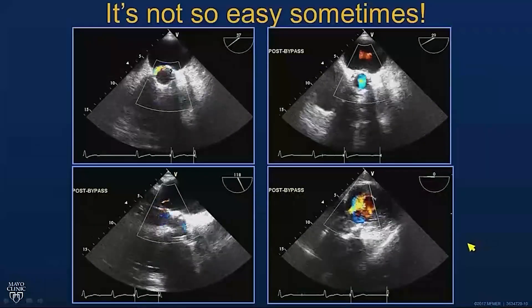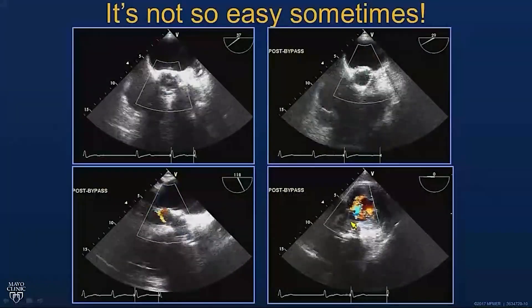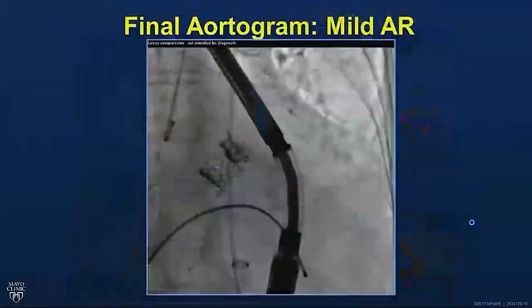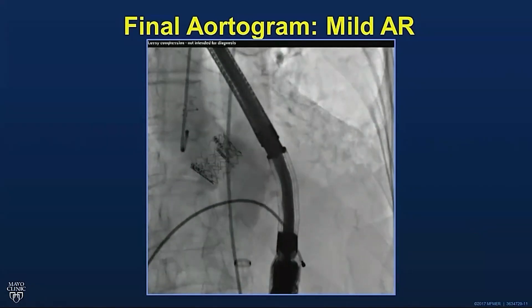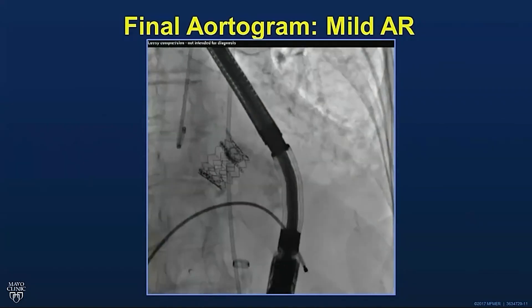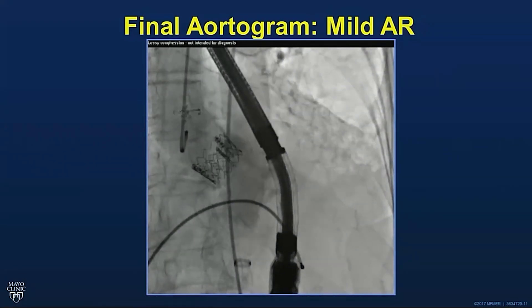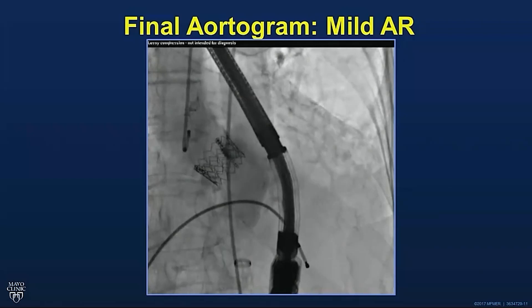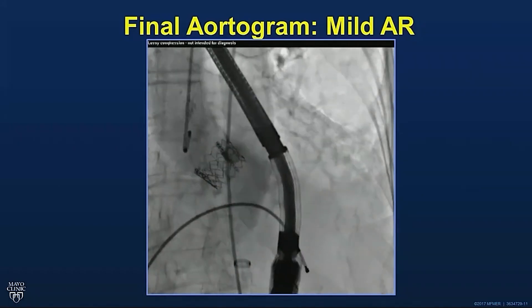Sometimes it's not so easy. Here's another case with periprosthetic leak visible here. This is a deep transgastric view, which can sometimes accentuate the jet — it fans out pretty well. That patient ended up having an aortogram; their creatinine was good, and there was only mild AR. The key thing is to assess right at the valve level in the short axis view, use multiple imaging modalities, and be aware that you can have reversal of flow in the descending thoracic aorta due to aortic stiffening without significant aortic regurgitation. If you don't have significant reversal in the descending aorta, chances are the AR is not that significant.